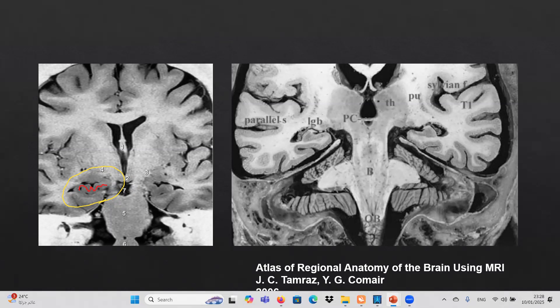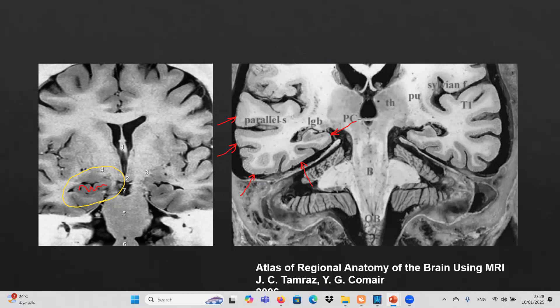In this coronal image we have many gyri to identify: the parahippocampal gyrus, the fusiform gyrus, inferior temporal, middle temporal, and superior temporal gyrus. We also have an important sulcus here called the collateral sulcus, located between the parahippocampal gyrus and the fusiform gyrus. This is the anatomy of the temporal lobe.